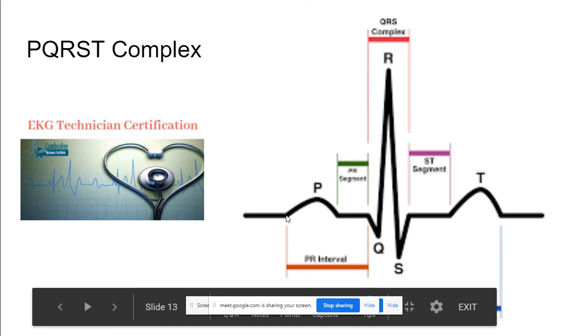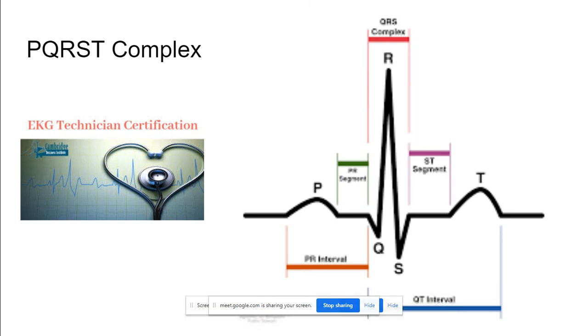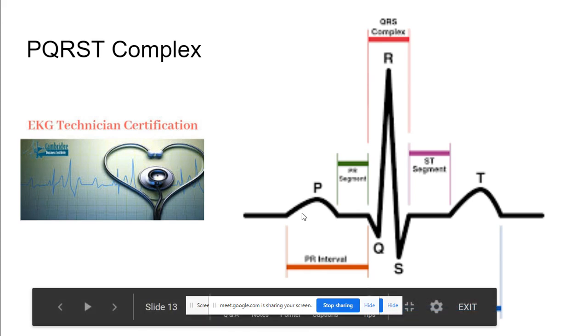So it's like how long it took the atria to talk to the Q, and when did the Q finally answer from the ventricles. So if this PRI is super long, that means the conduction from the atria to the ventricles took forever.